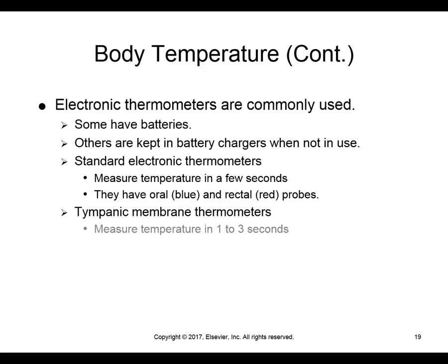Tympanic membrane thermometers measure temperature in 1 to 3 seconds. That's the really nice thing about it, because you get such a quick temperature. And they risk the spread of infection less, because they go right into the ear, which is less apt to promote an infection. They do have covers on the end of the tympanic thermometer probe.